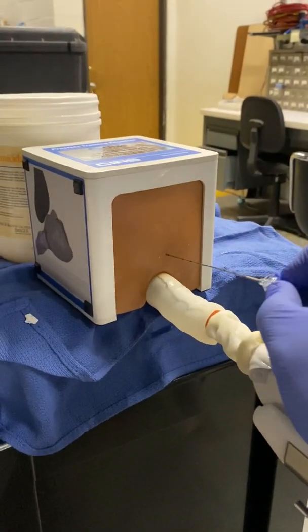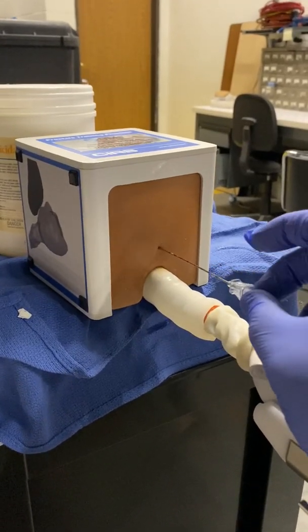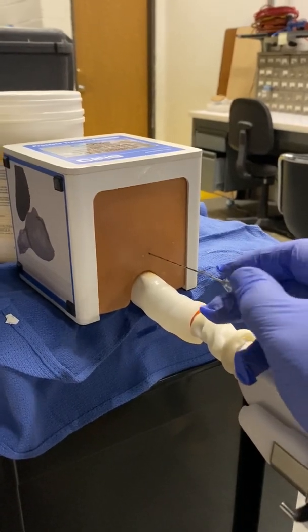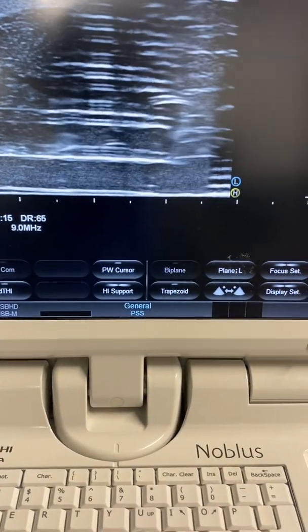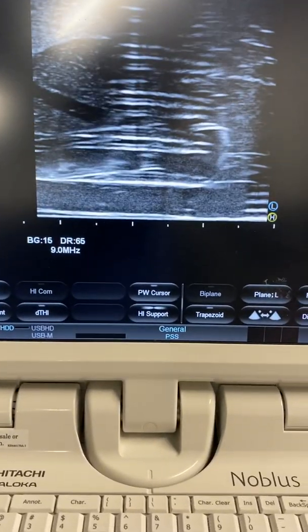Remember, we went through a lot to make sure the needle is in the correct spot and won't move. If they're just trying to screw something on, it might move slightly. So I got in the habit of watching the screen while they're screwing it in. If I notice that it pushes in or moves slightly and you lose sight of it, let the doctor know.